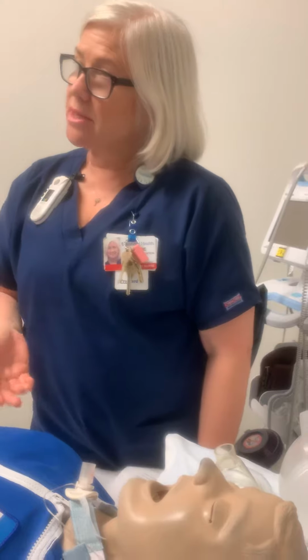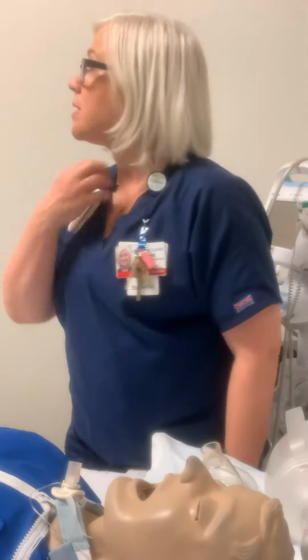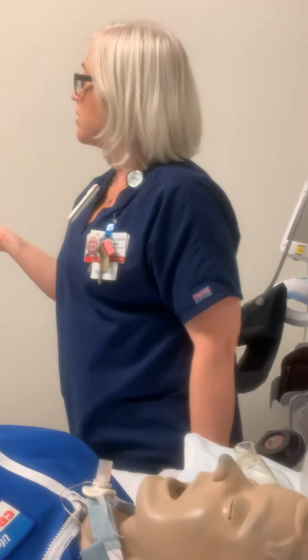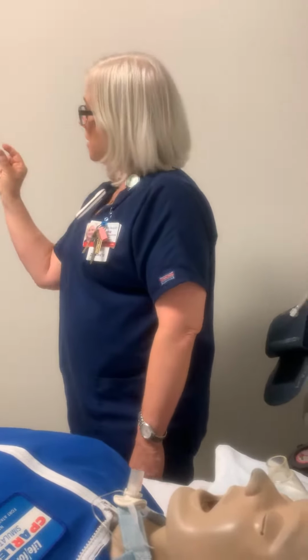So you know they've got a laryngectomy, but they may come in with still a temporary trach, okay? Or they'll come in with just a laryngectomy and they have their stoma, but they're not putting their Larry tube in. And a lot of times when I see patients that come in with Larry tubes, I'll ask them in the hospital, I need you to bring your Larry tube. Where is it? Well, they'll usually tell you it's in the trunk of the car. What do you call it, a Larry tube? A laryngectomy tube. It's just a small, little, tiny curved tube. Oh, that thing that they slip in there. Yeah. Okay. And it helps keep that stoma stable. And I always like to have them in because if I ever need to use it to ventilate them, it just provides more stability. But they don't always wear them.